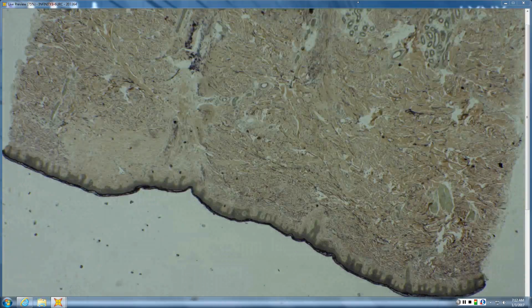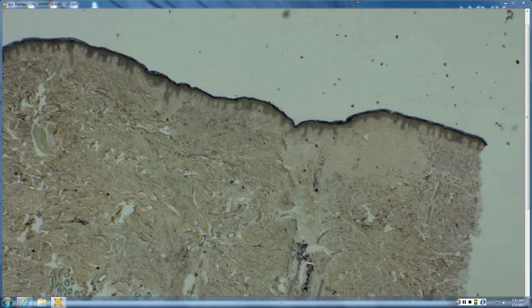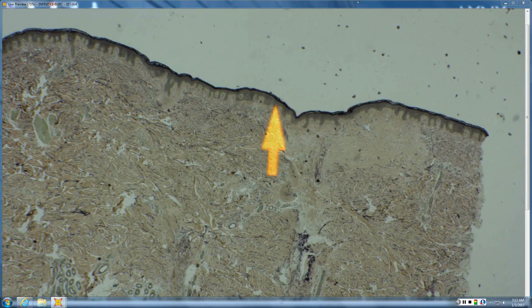Well, this one is your classic Lichen planopilaris. And so remember before when I was saying that with lupus, the inflammation, the damage really starts at the isthmus, and that's where all the scarring would occur. And if you did a VVG, you can see that a little bit better. Whereas with Lichen planopilaris, it's almost all infundibular location.